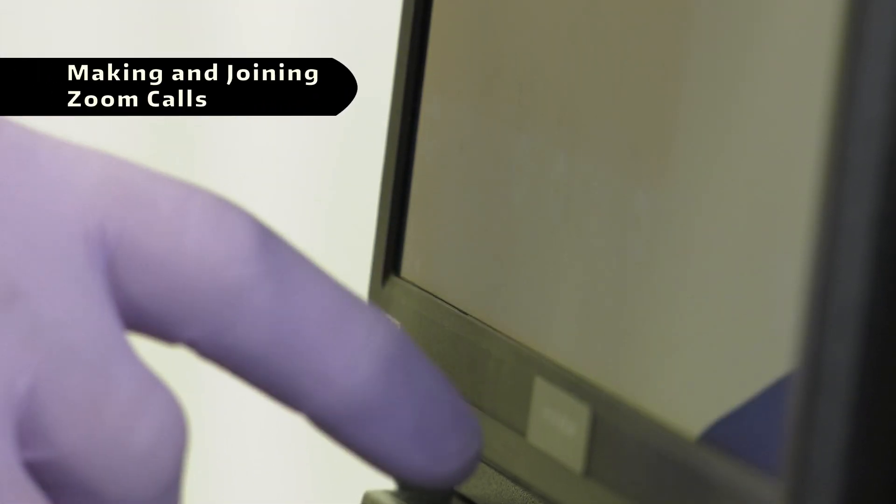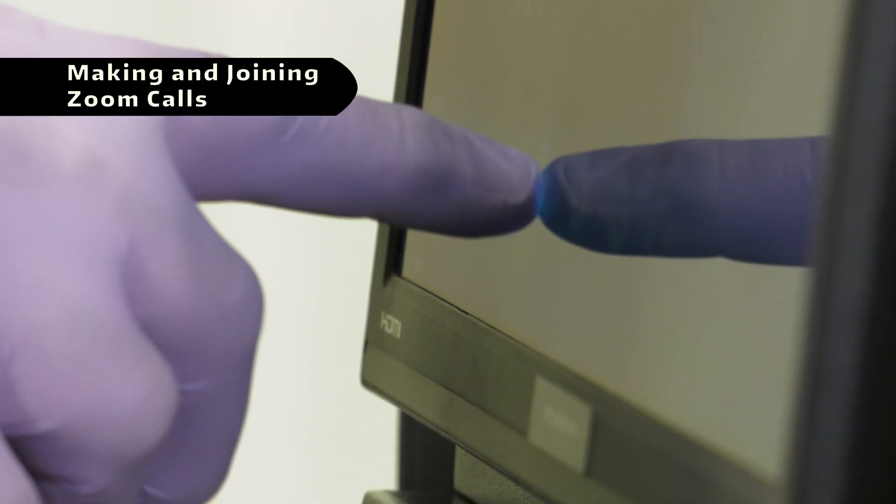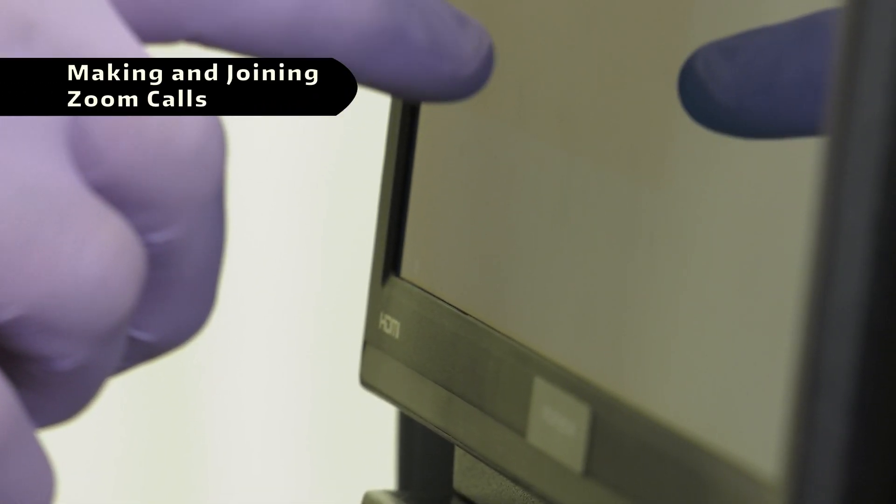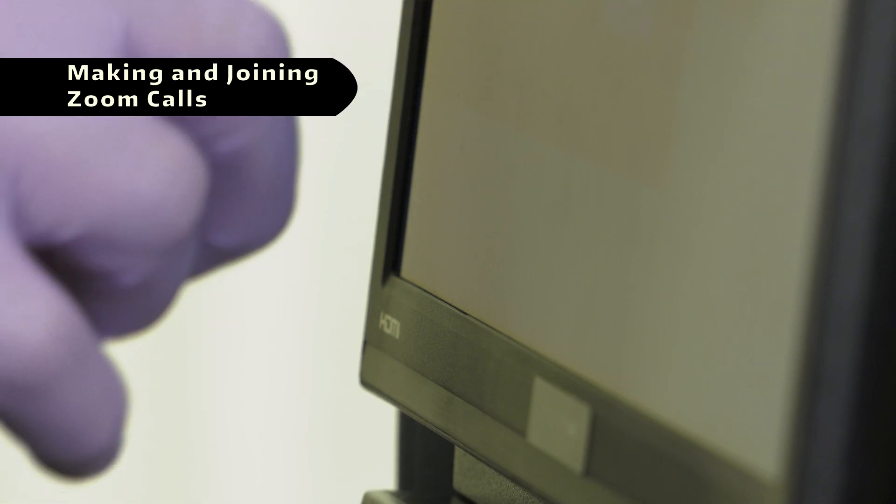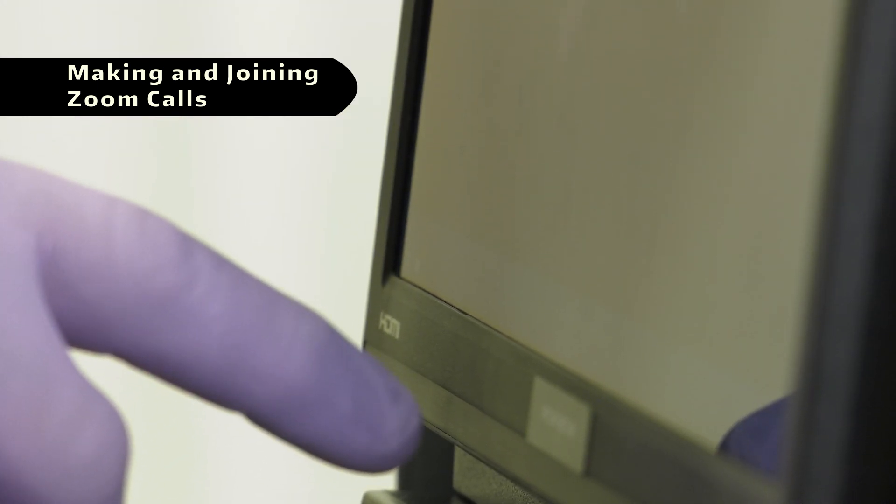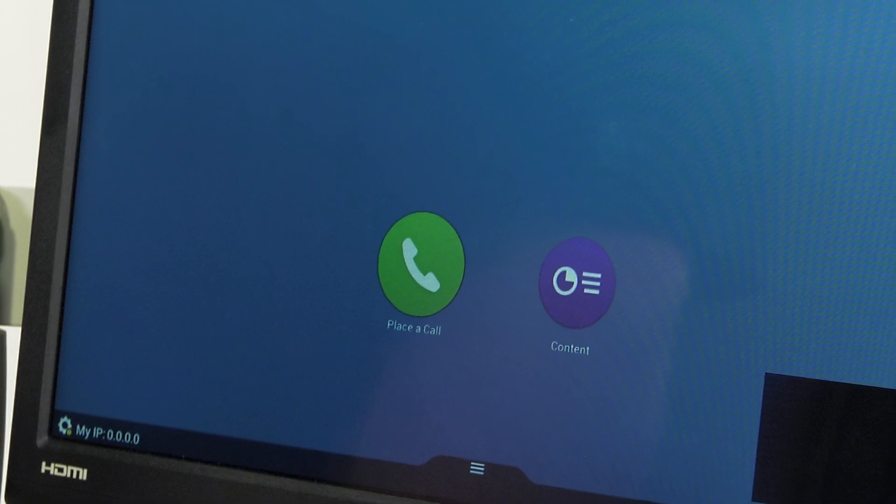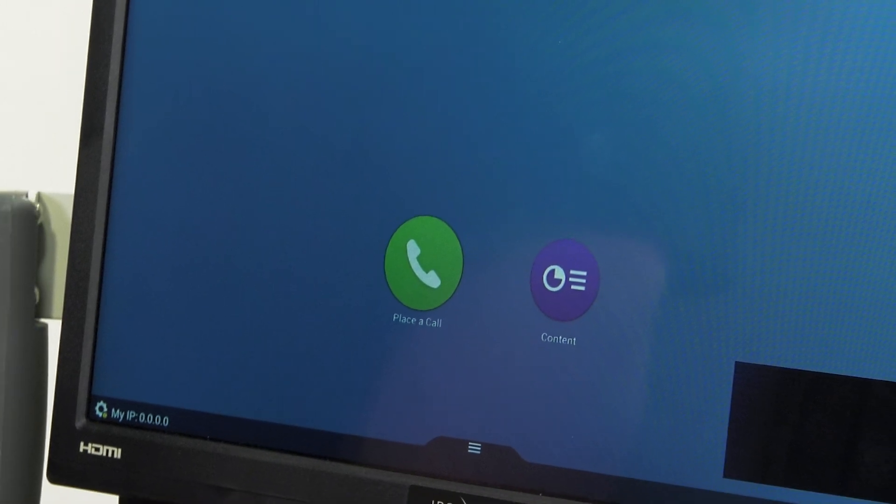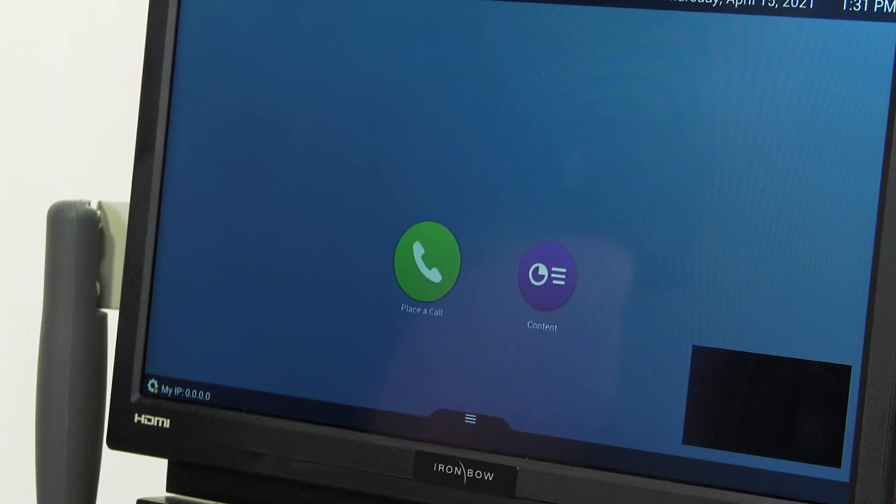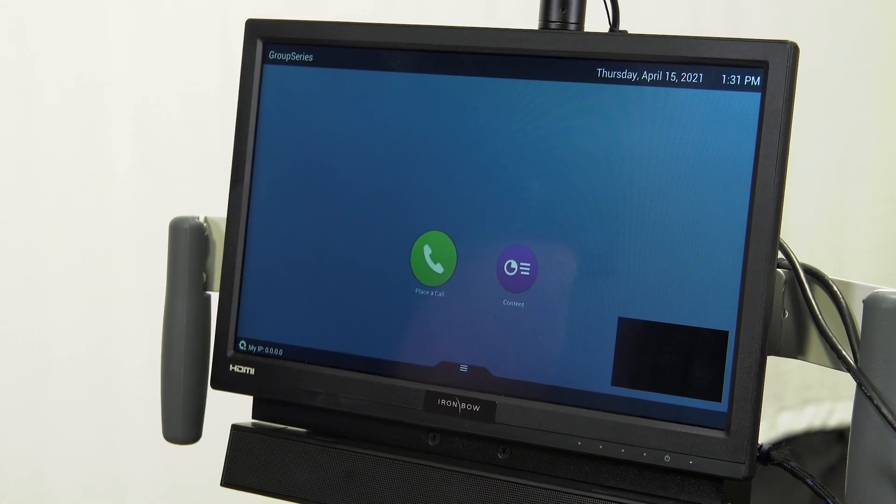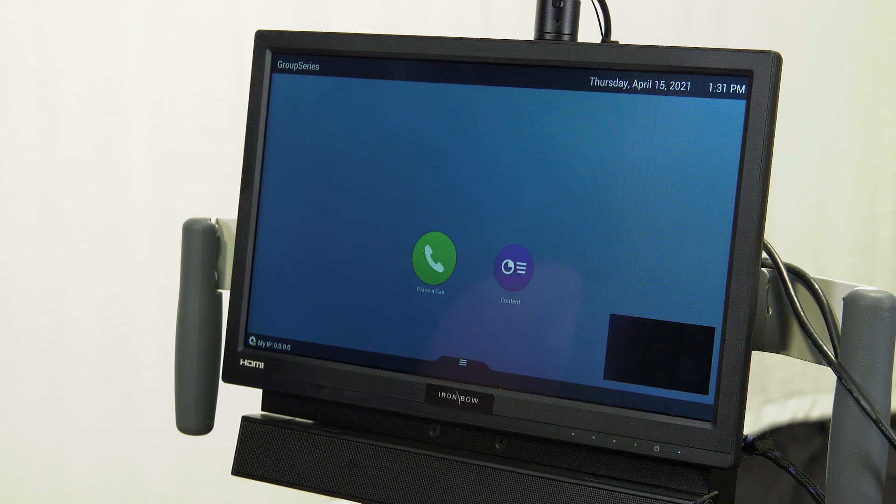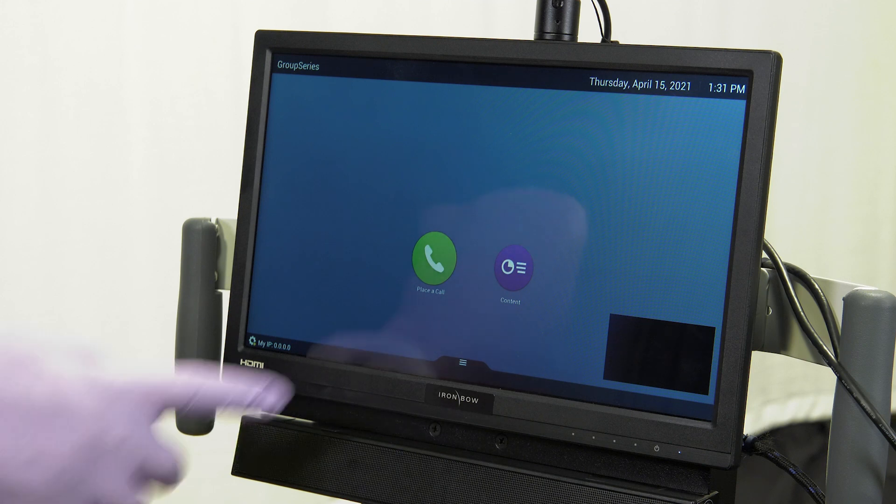Before making a video call on the cart, you will need to make sure the teledentistry cart and laptop are both configured and connected to the network. Making a call on the teledentistry cart is done via the on-screen menu of the Polycom unit. From the main menu, tap the Place a Call button to open the dial pad menu.